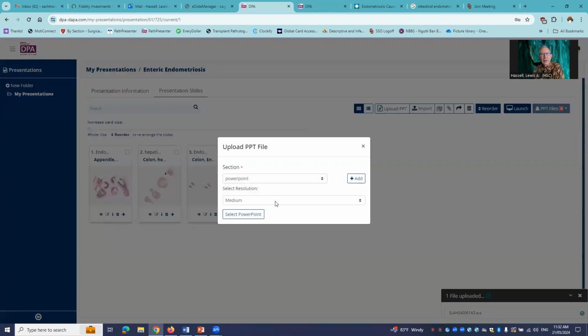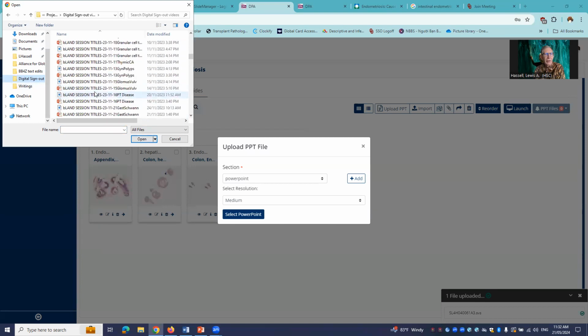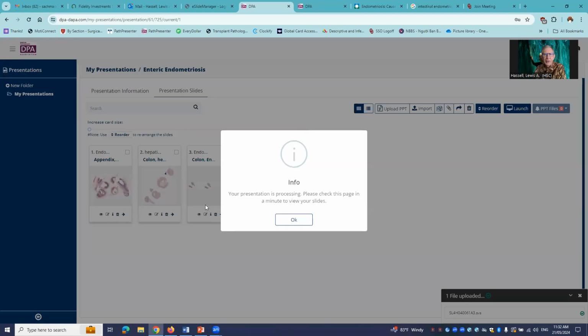So here we go. We're going to select my PowerPoint. I'm going to select it from my files, which include a number of digital sign-out video materials. And we'll come down here to the most pertinent one, which we have prepared, colorectal endometriosis, and select that. Oops, there. And then open that. And then this will begin to upload these PowerPoint slides into the presentation. Now, this process usually takes several minutes.